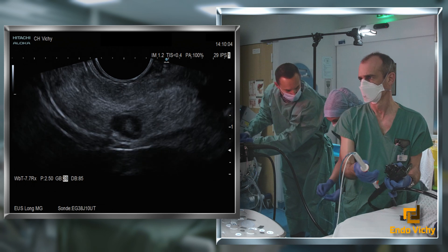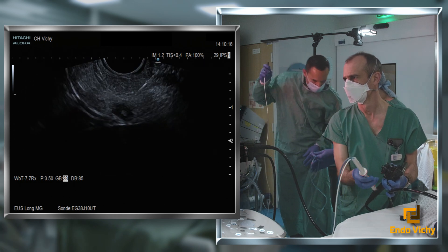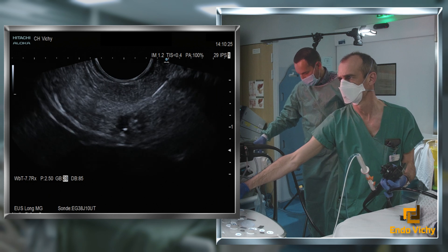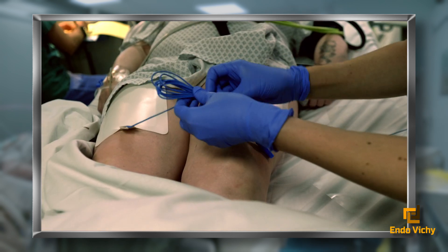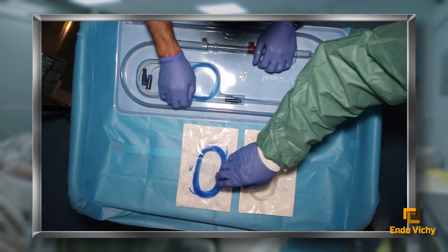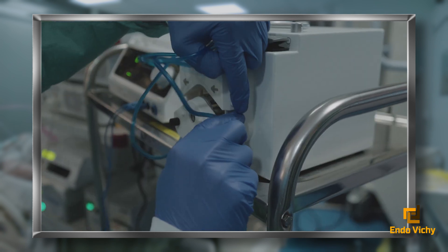We will perform the treatment using a 19-gauge EUSRA needle combined with a VIVA combo radiofrequency generator. The needle is then connected to the radiofrequency generator, set to a power of 50W. Two plates are previously glued to the patient's thighs. A water irrigation channel is aimed at cooling the needle. Once all the connections have been made, the actual radiofrequency ablation can begin.